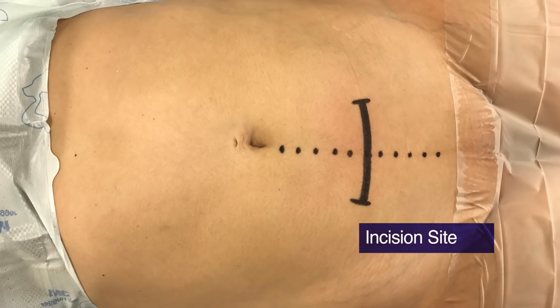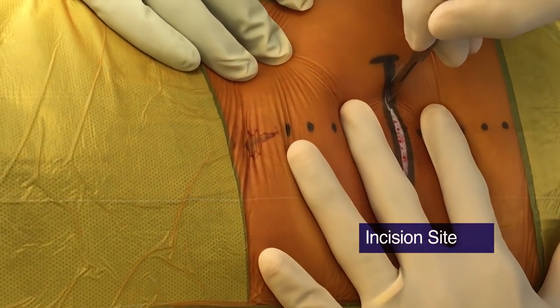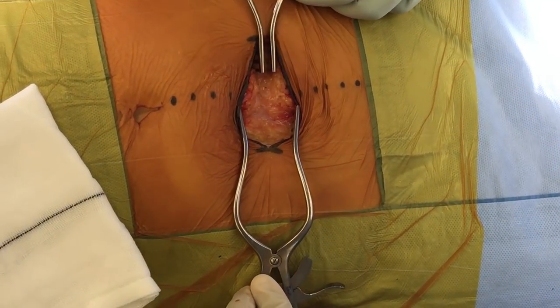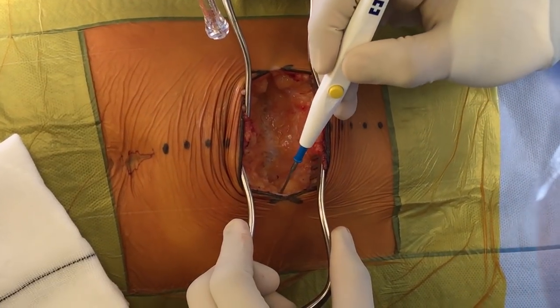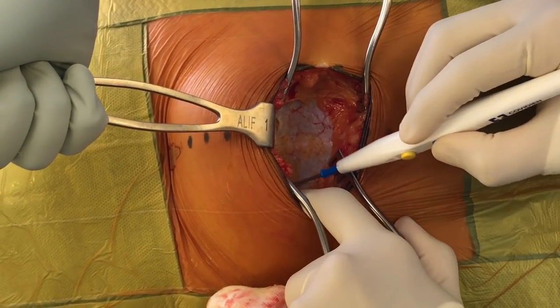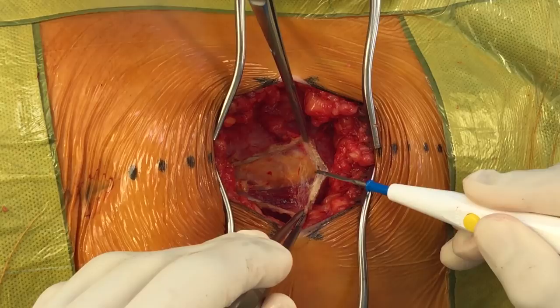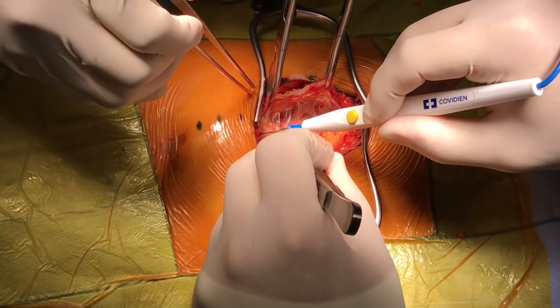For an L5-S1 exposure we prefer a transverse incision whilst marking the midline to get better positioning for the linea alba. Dissection through the skin and soft tissues is performed using diathermy, and a superior and inferior flap is raised to give us our vertical exposure. The linea alba is divided with diathermy and tissue forceps are used to help retract the left-sided rectus muscle to enable the retroperitoneal plane to be entered.